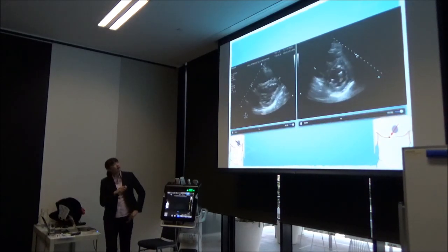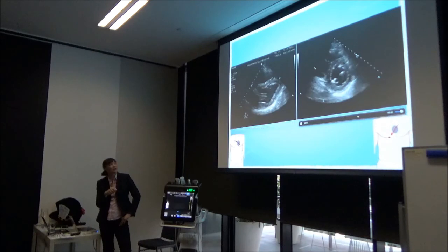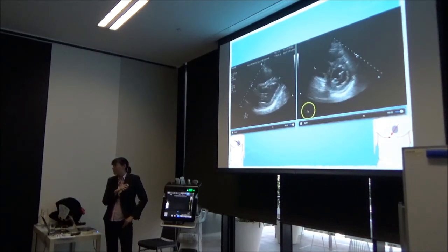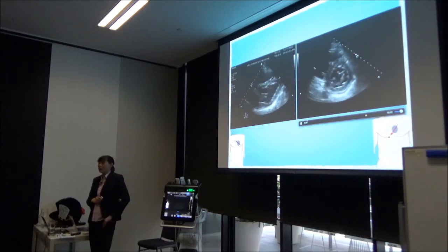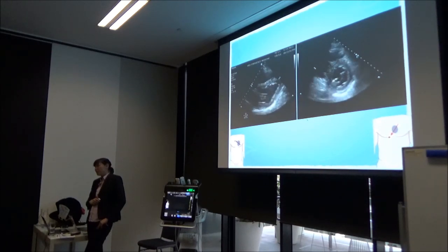So this is a parasternal long view. These are the same patient. What do we think happened between these two images? This is the same patient. So I have a crappy squeeze, in which case I want to give maybe some sort of pressor. That might be an inotrope. So we gave dopamine. Some cardiologists prefer dopamine.